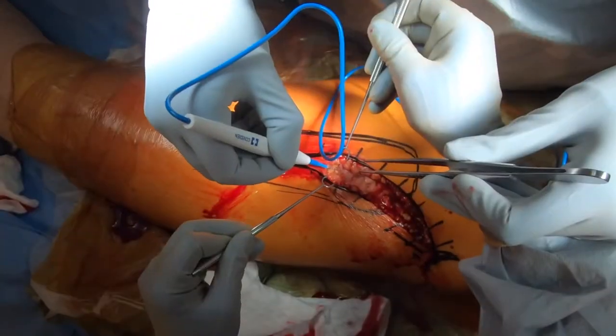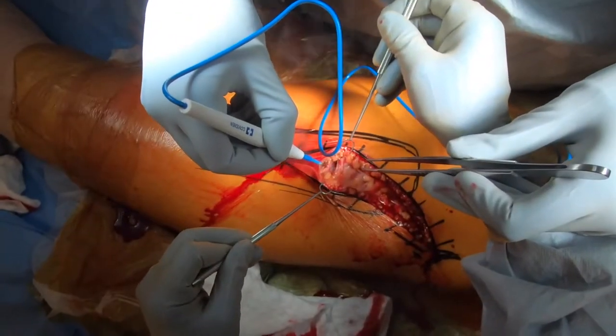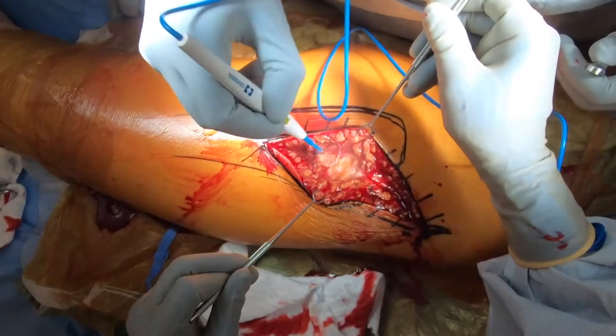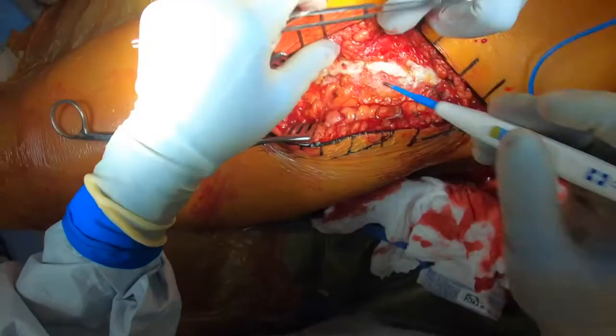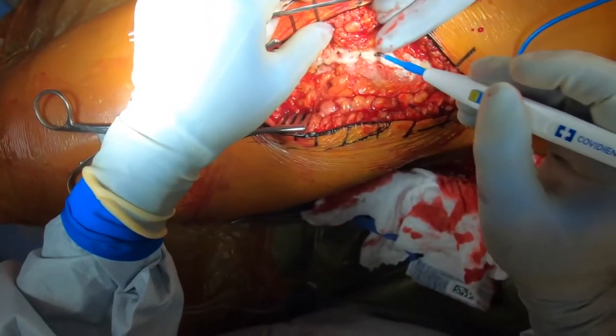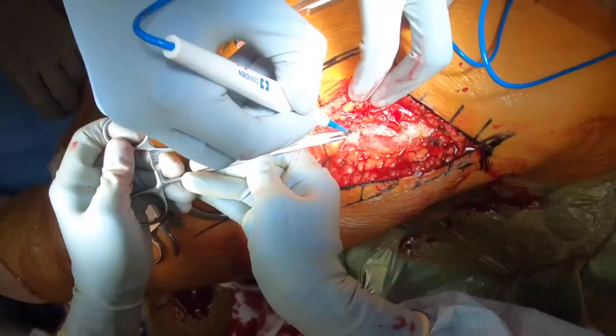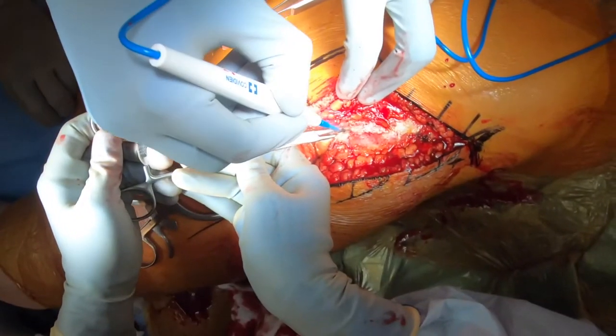The incision is then taken down to isolate the iliotibial band. The IT band is then marked and bovie cautery is used inside the IT band.